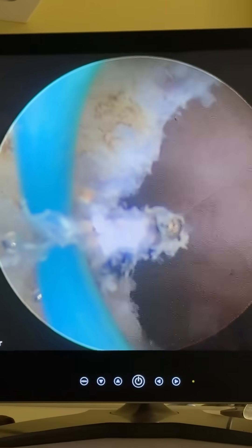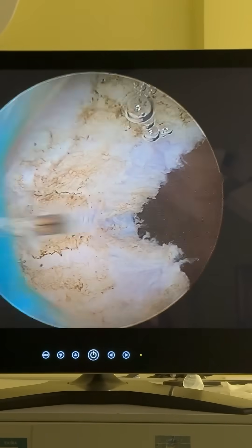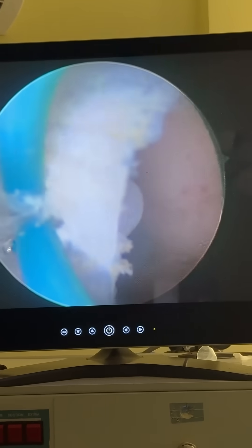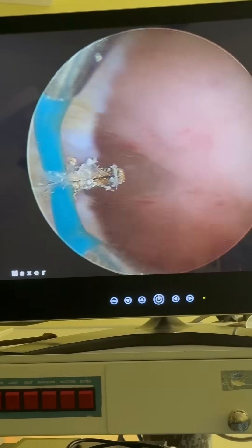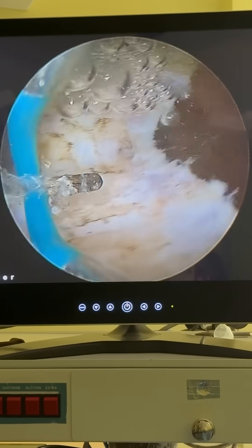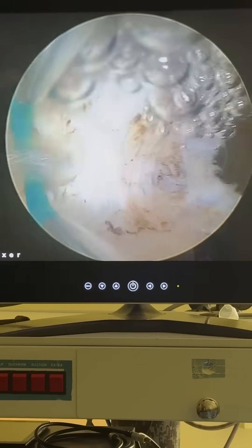This is a procedure of septal resection. As you can see here, I am using the resectoscope. This is a monopolar cautery with glycine as the distension media. The septum is a deep one — it is extending almost till the internal os, and it is fibrous, as you can see here.